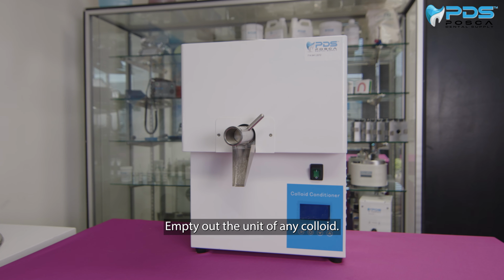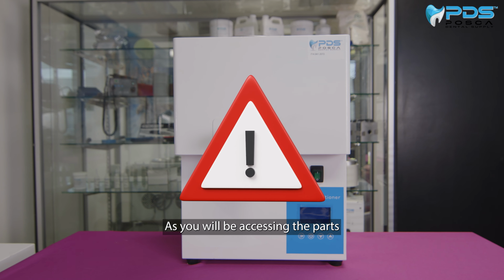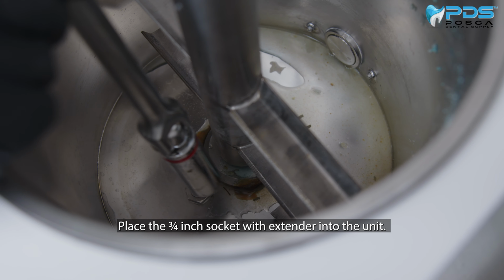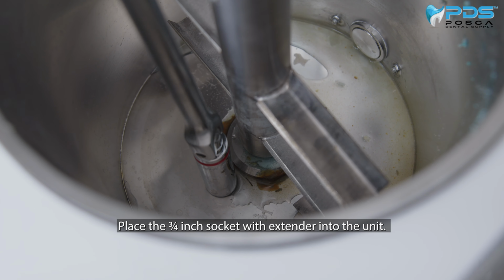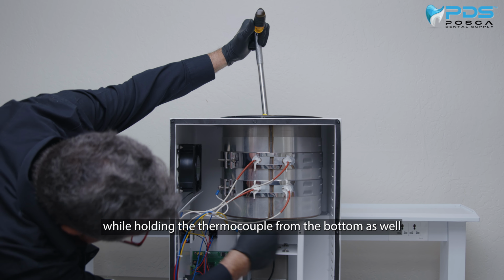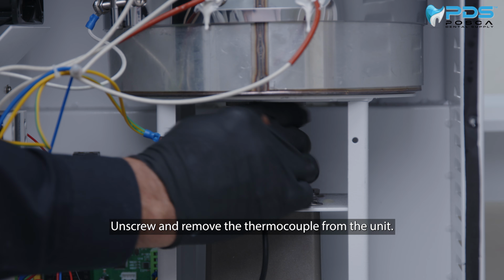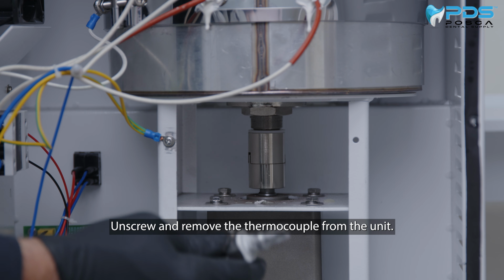Empty out the unit of any colloid. Ensure the tank has cooled off, as you will be accessing the parts from within and underneath the tank. Place the 3/4 inch socket with extender into the unit to unscrew the thermocouple while holding the thermocouple from the bottom as well with the wrench. Unscrew and remove the thermocouple from the unit.